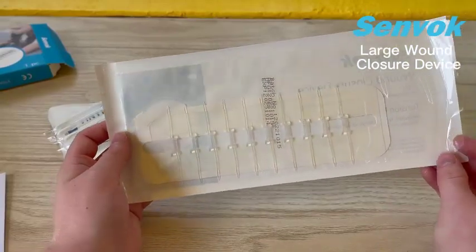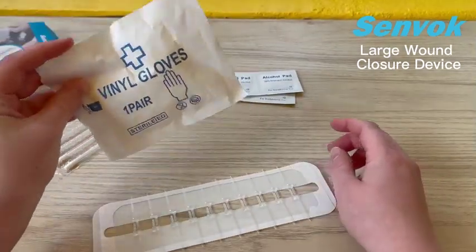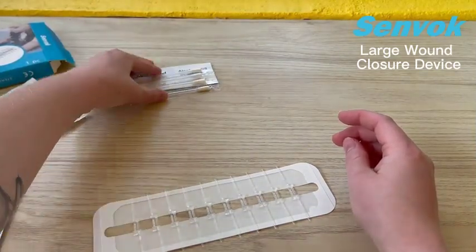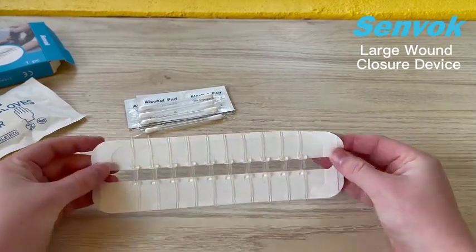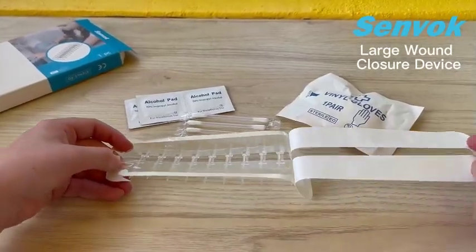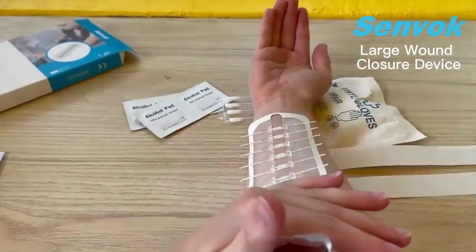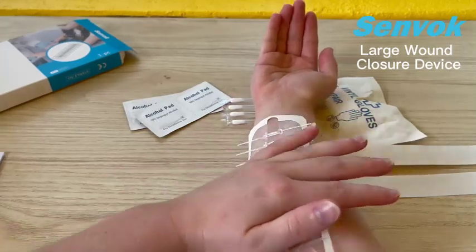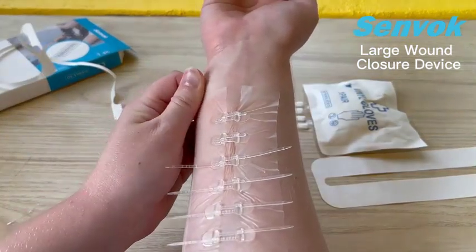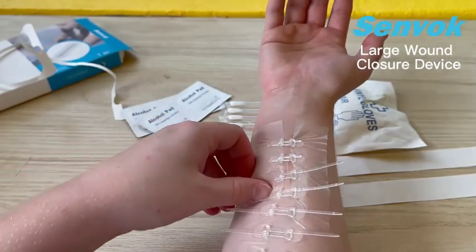Let's take it out and demonstrate how to use it very basically. Once you have put on your gloves and cleaned the wound with the alcohol pads and Q-tips, and gotten that wound nice and disinfected, we are going to take out the wound closure device. We remove the protective backing, and you would place it around the wound. Once you've got it on, you can take the paper off. That is absolutely fantastic — that is going to help that wound close up and heal. This is absolutely a must-have and essential for your first aid kit.